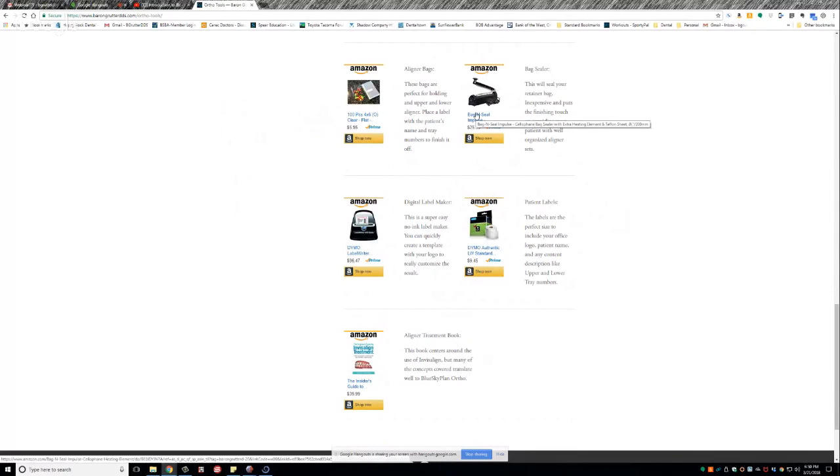So that's that. If you are looking to learn more about aligners and the mechanics of aligners, yes, I have courses, and I'd be happy to teach you. But there's also a great book. It's based on Invisalign, but it's really just about plastic. It talks about how to move teeth with plastic and how teeth will respond. So it's a great resource as well if you're just getting into it.